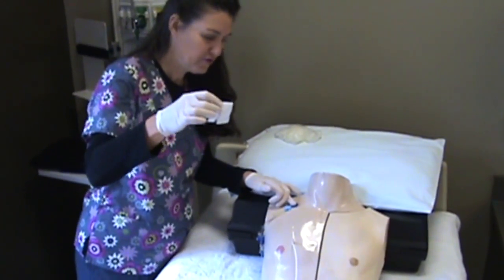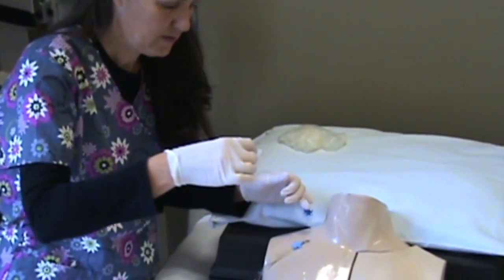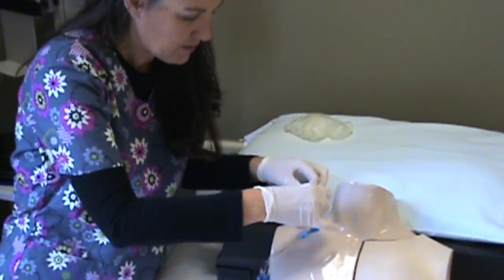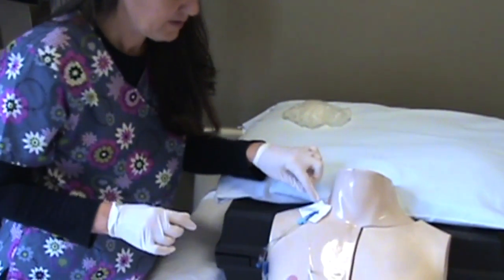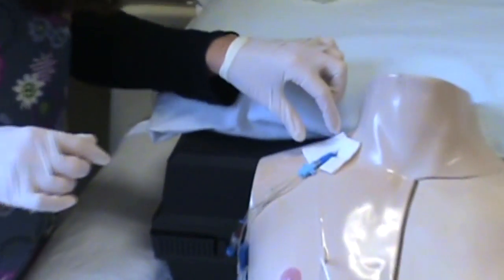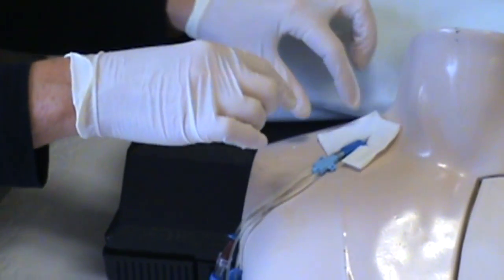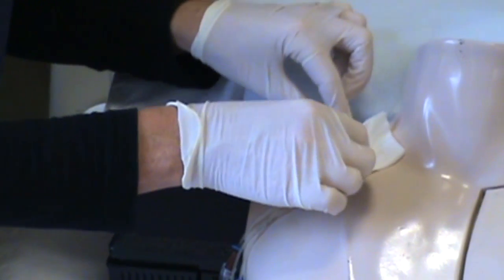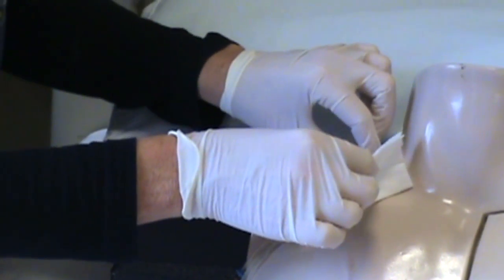This little drain sponge right here is meant to go right here if it's really draining or bleeding under the tegaderm. But most of the time you want to see your site, so you will leave this little drain sponge off, out of the way.